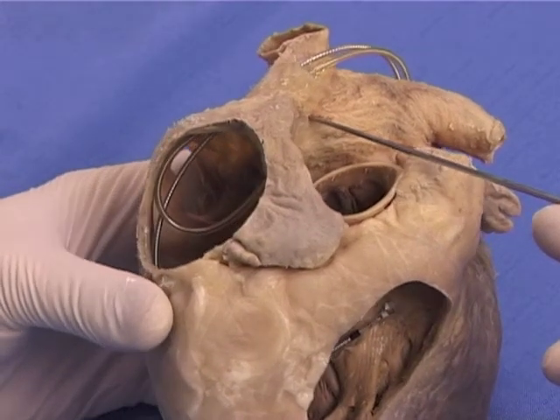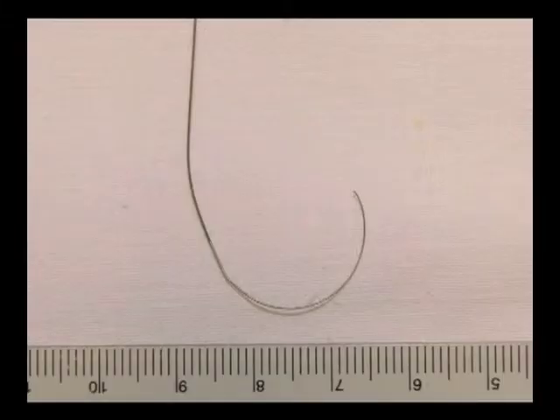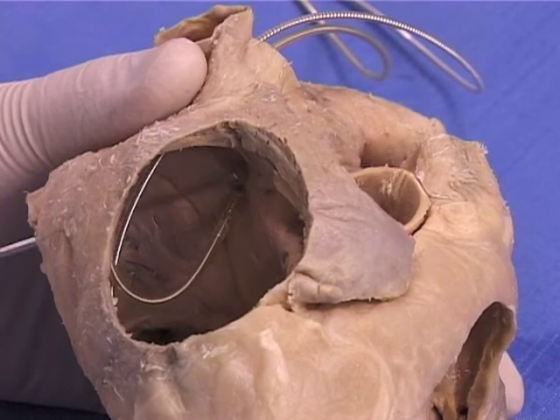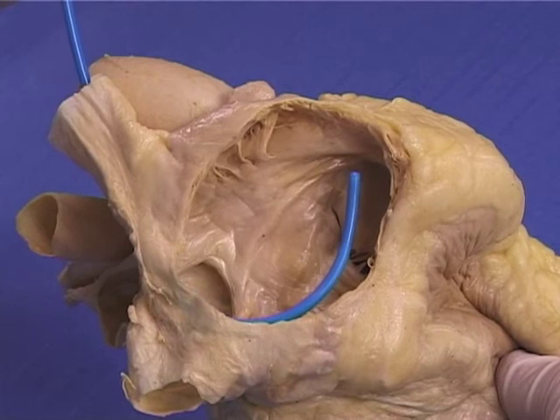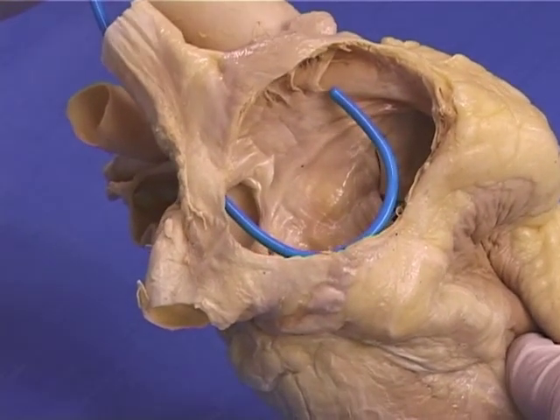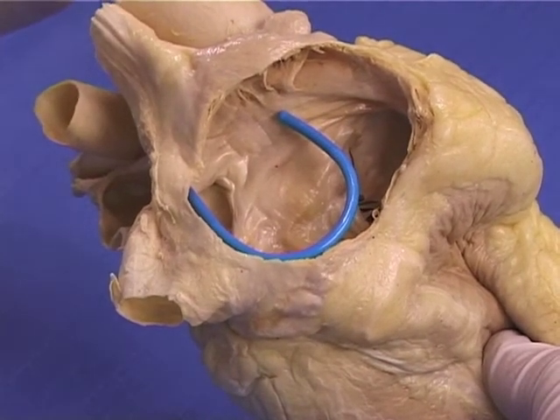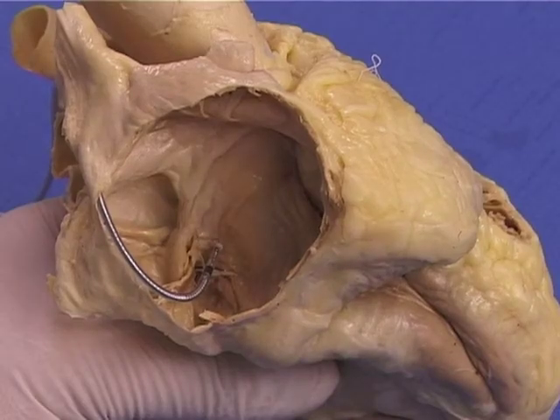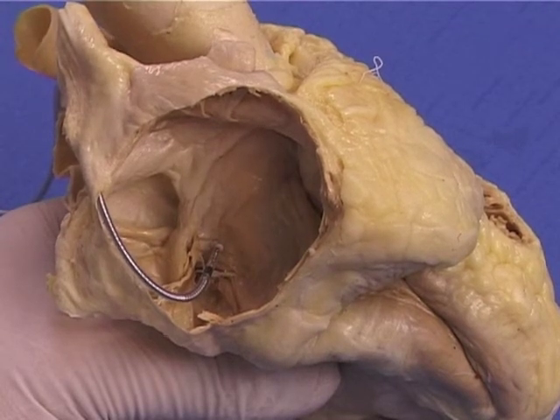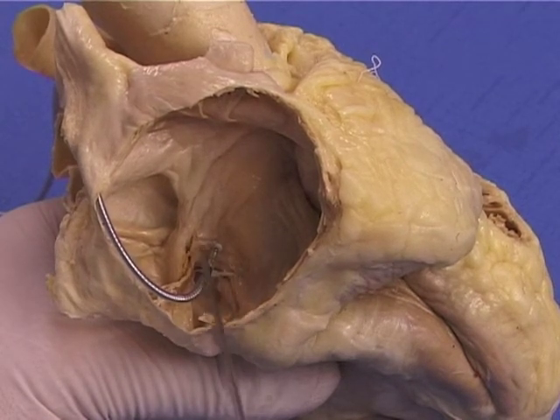While positioning a lead, it is necessary to configure a small curve of the stylet and to position the lead tip in an anterior septal area. For positioning of the lead in this area, a special system was developed with a steerable introducer and a thin lead inside. The implantation of a lead into the coronary sinus region is carried out while positioning it in the lower posterior part of the atrial septum.